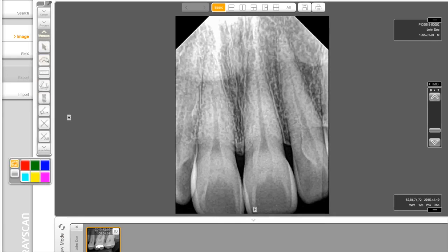Below that, you can do angles under the Measure section. You have a standard single line measurement, and a single left click will start and stop. Also, you can do a multi-line, or tape line, so you can do multiple measurements.